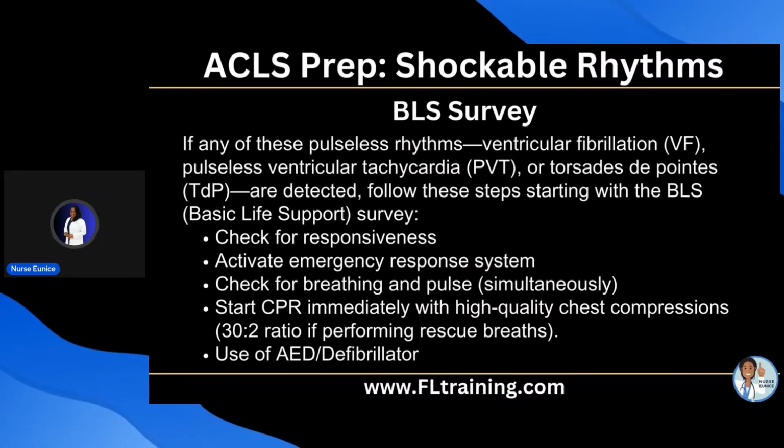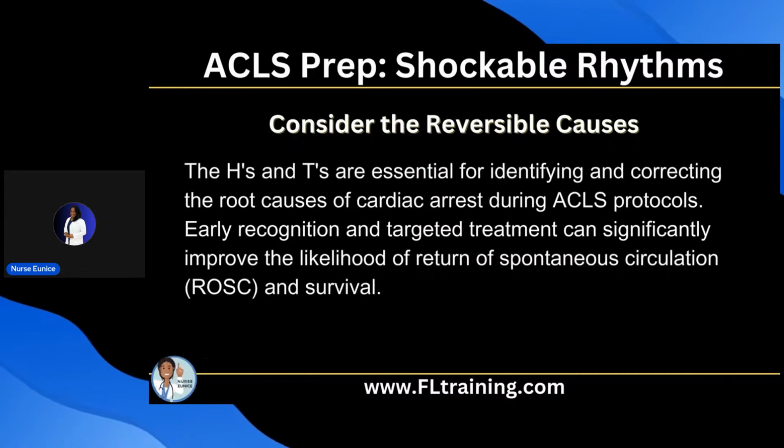And if you have your bag mask device there, you're going to be alternating. After 30 compressions, you're going to be giving 2 breaths. If you don't have any equipment yet because your team hasn't arrived with a crash cart, you're just going to continue doing those high quality compressions nonstop until the team arrives with the additional equipment that is needed. And now when the AED arrives, we will use that also.